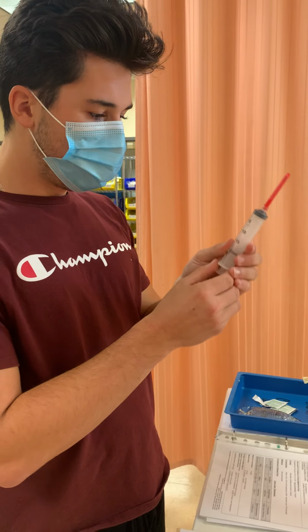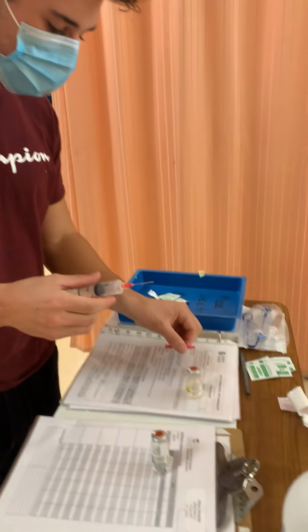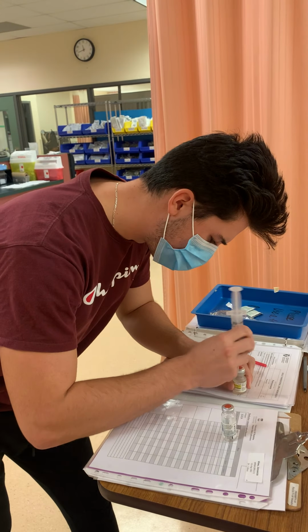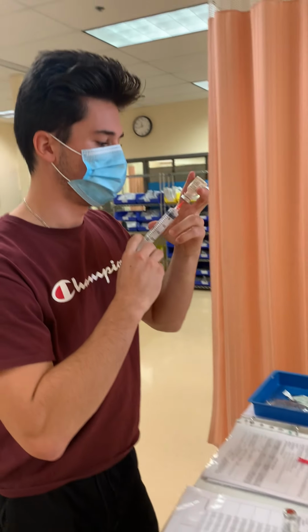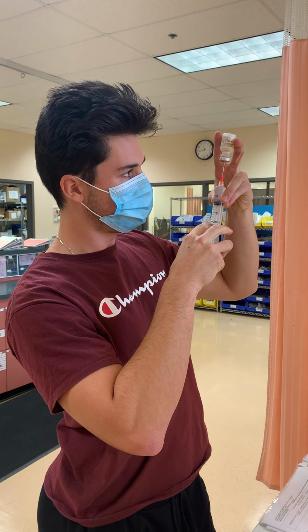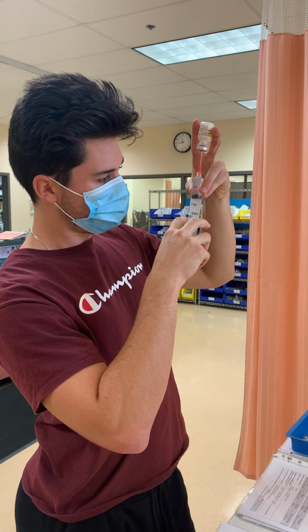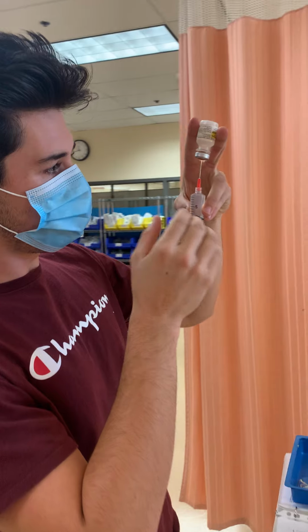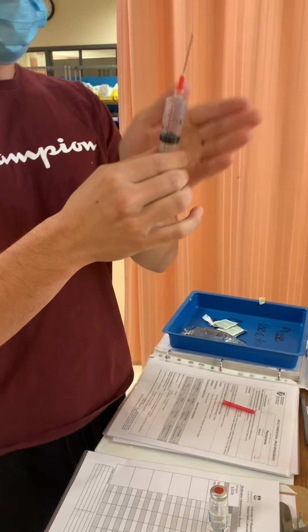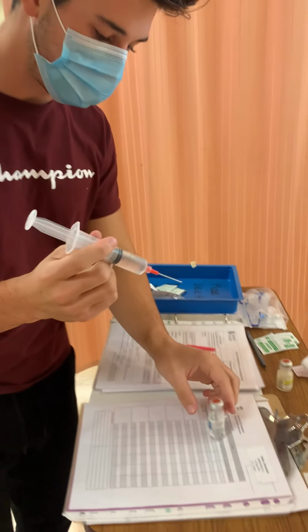So I can pull up 10 mLs of air that I'm going to need to inject into my vial of normal saline. I can go ahead and inject my 10 mLs of air. I'm going to pull up my 10 mLs of normal saline. Then I can see that I have no air bubbles, so I am good. I see that I have my 10 mLs that I need, and I can go ahead and inject my 10 mLs into my medication vial.